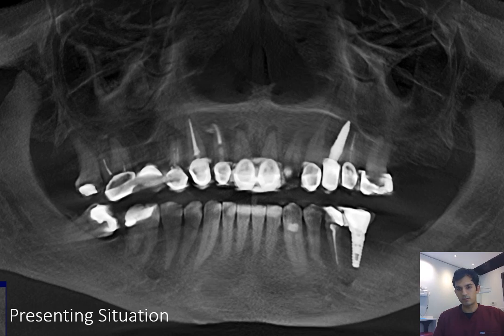His previously done implants, these are many years old now. The restorations were breaking down. We have chipped ceramic and open contacts. So he really needed a lot done. But with his limited finances, we had to identify what had to be addressed most urgently and start with that.